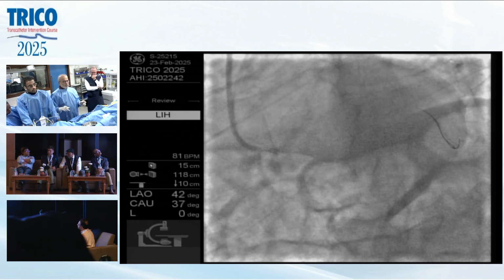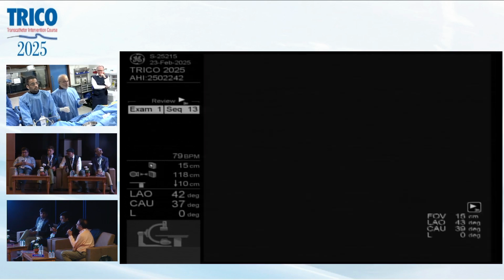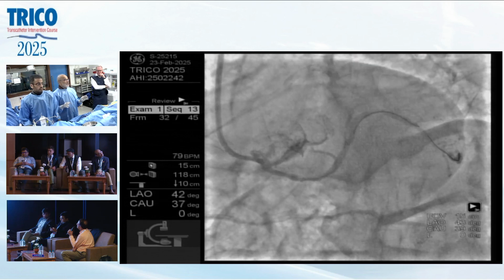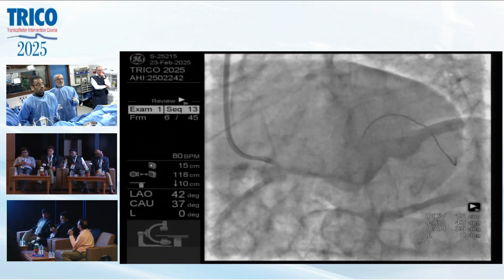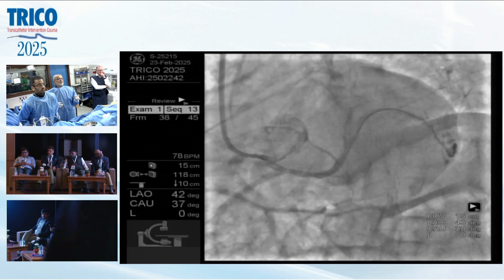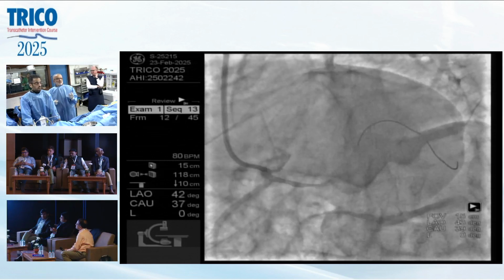With Onyx and Cruise, when I take a stent, like if I choose 28, 26 Onyx or Cruise maybe 34, it looks a little longer than what it should be. I don't know why. It should not be. They must be keeping proper care, but somehow visually I feel that way. So here I will take 3 by 34. It will look a little longer.